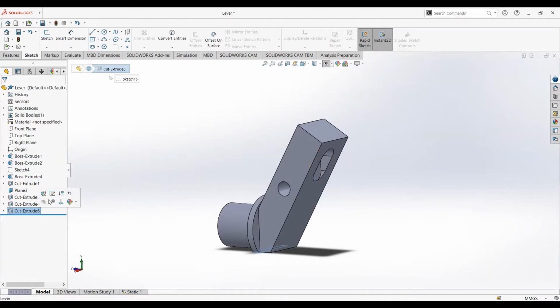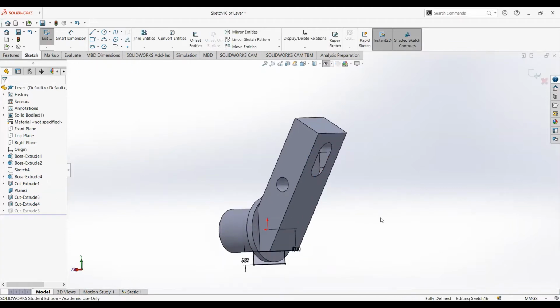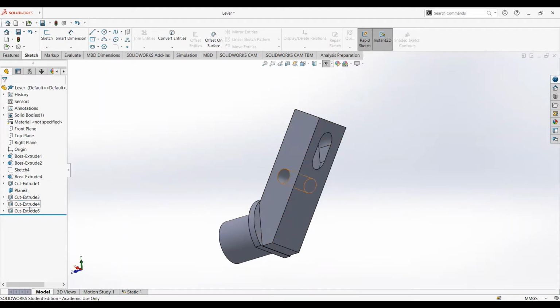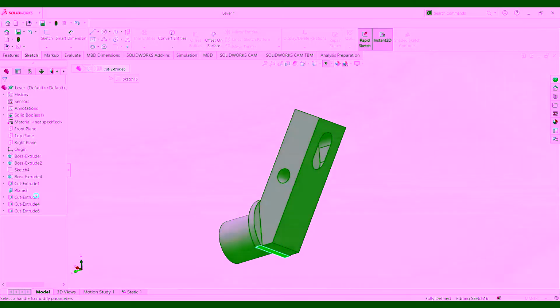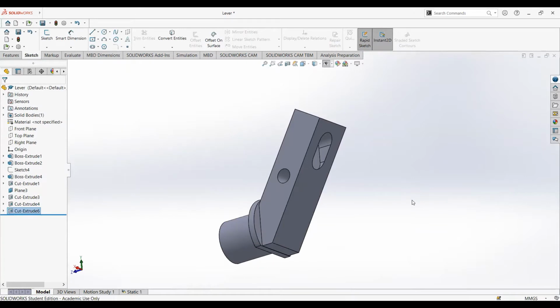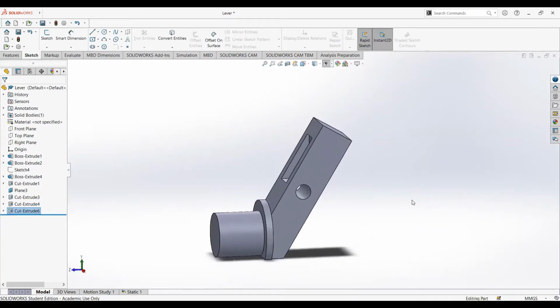After that, we sketched this and then we're going to cut extrude this as well because this will make the lever fit in our device better. And we cut extrude it by 10 millimeter or through all, so this side is gone. So yeah, this is how we created our lever arm. Let's move on to next part.